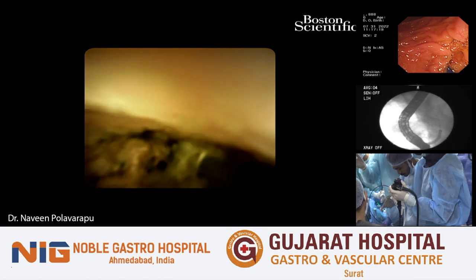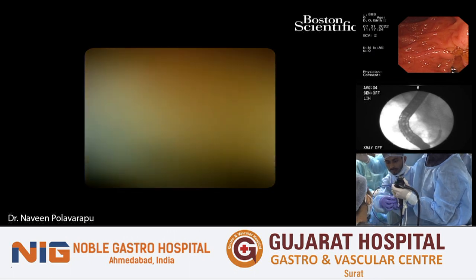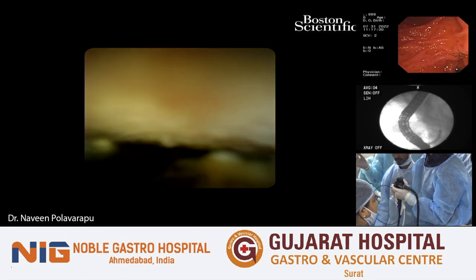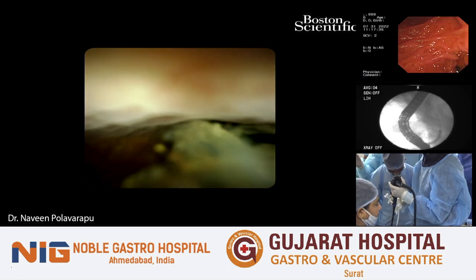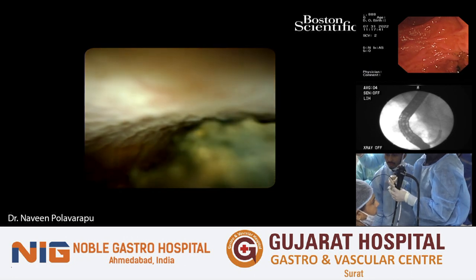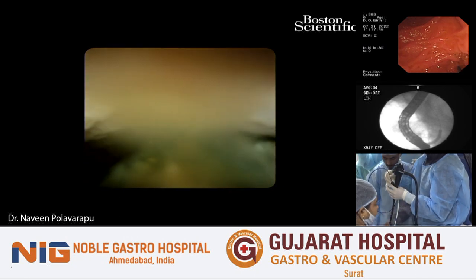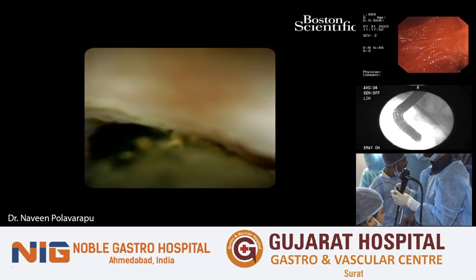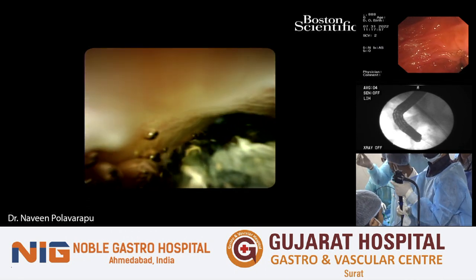Irrigation, what is happening? I'm just going above the stone to see. Dr. Naveen, is it necessary to go above the stone in all cases? Not necessarily, but I just wanted to make sure that there's nothing else beyond it. Now that I know that there is a stone there, I just want to make sure we're not missing anything else.